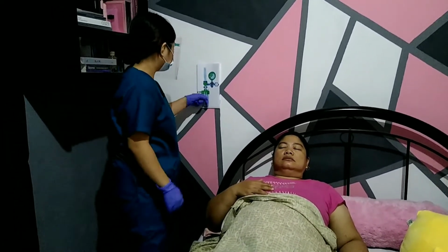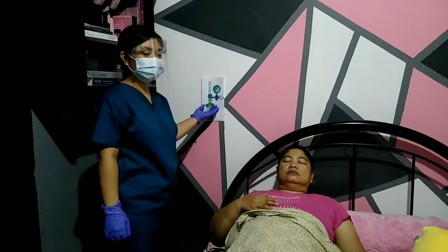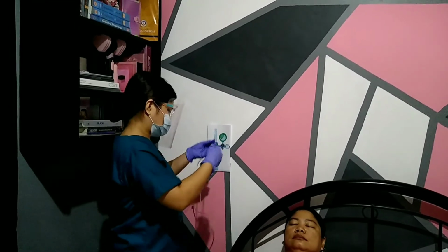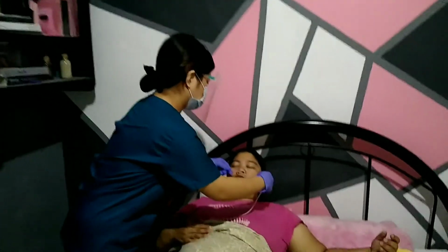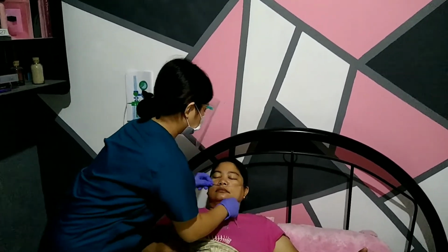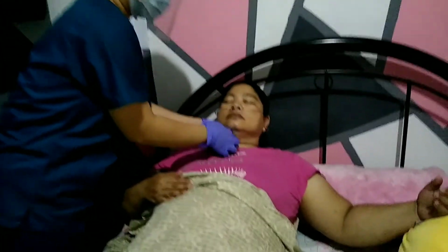And then attach the oxygen delivery device to the oxygen tubing. Attach it to the humidified oxygen source adjusted to the prescribed flow rate. And then apply the oxygen device now. We are going to use the nasal cannula first, and then attach the tubing first to the oxygen source, and then place tips of cannula into the patient's nares, loop tubing over the patient's ears, assuming that there are tips of cannula here, and then adjust the lanyard. Okay, that's it, adjust.